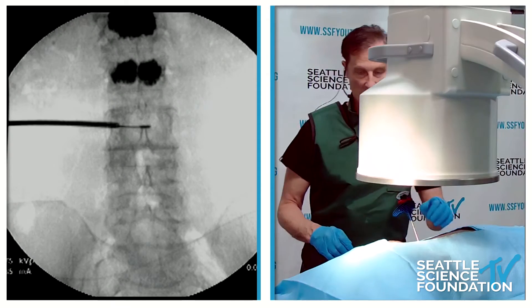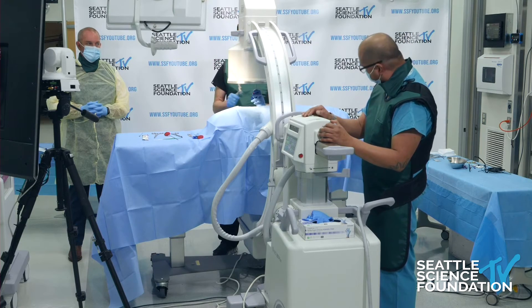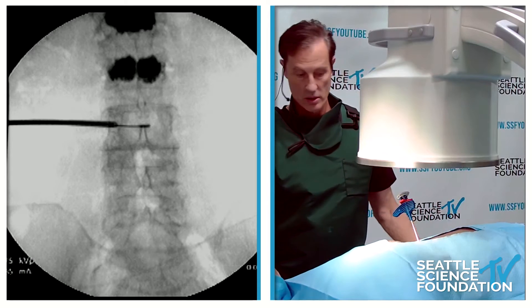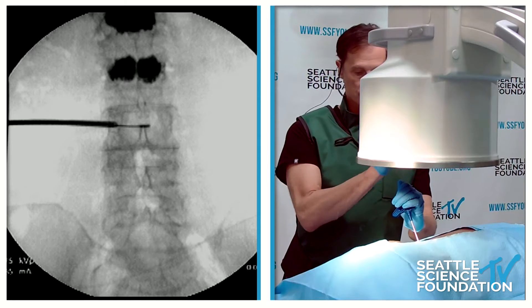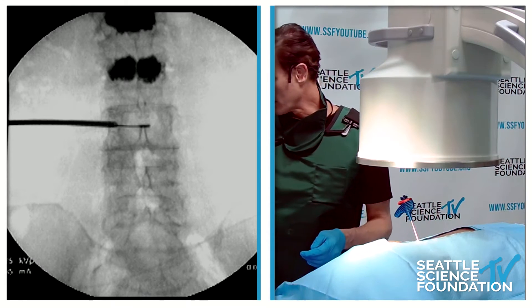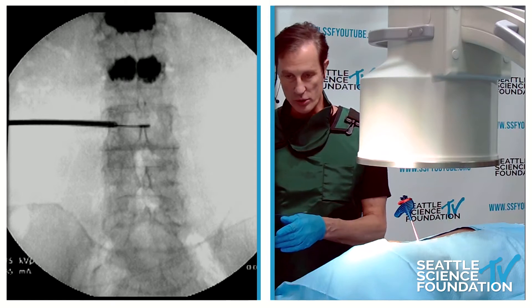That is absolutely perfect. I'm going to drive it just a smidge farther, take the stylet out, and we'll take the probe. We're not going to take the time to burn, but I will show you the probe.